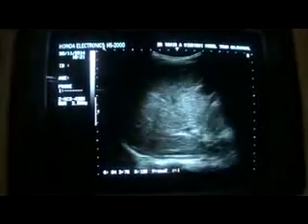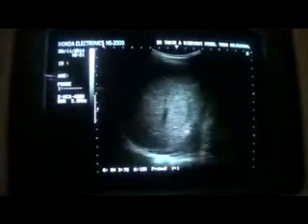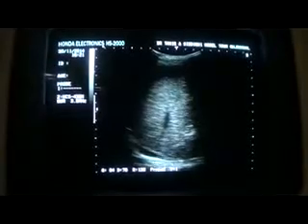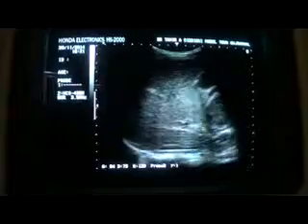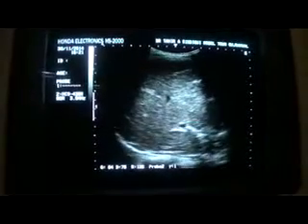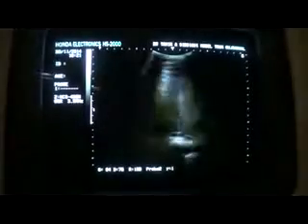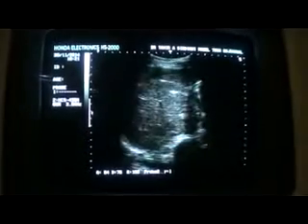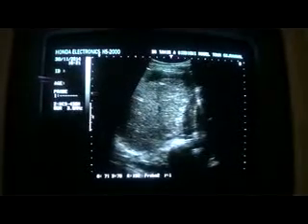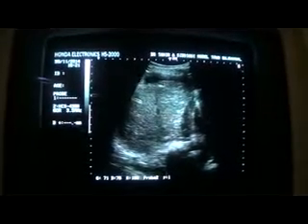not cirrhotic. Not every liver. You have to see certain parameters before labeling it as cirrhotic. Now this liver is appearing brighter than normal. Why? Remember that whenever you see fluid surrounding the liver, as in this case, the echogenicity of the liver will appear greater as compared to the normal.